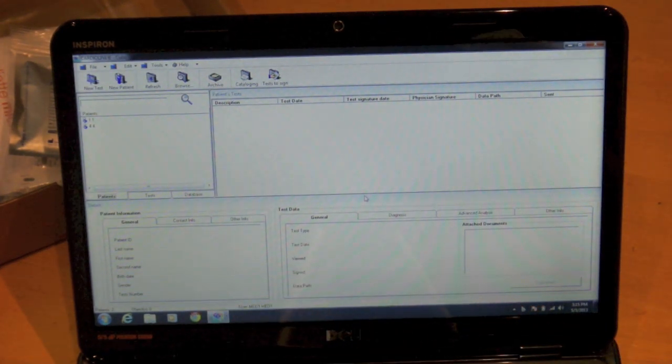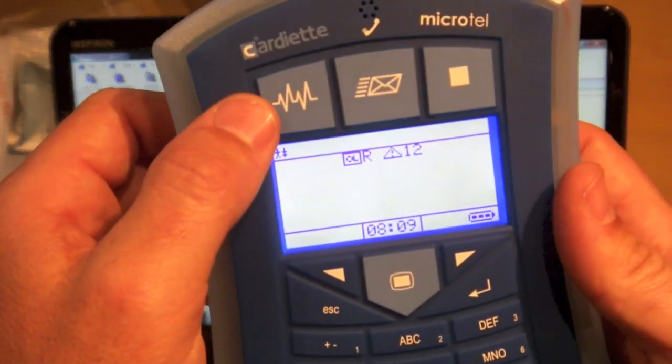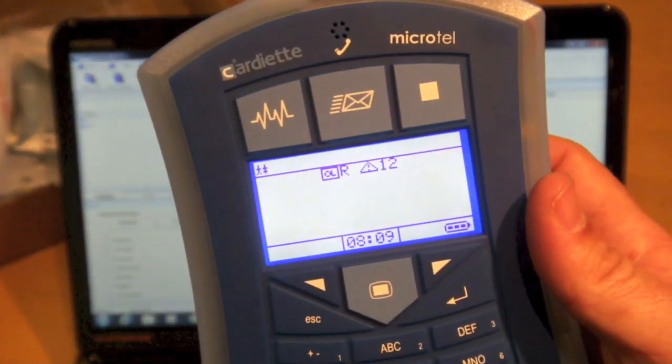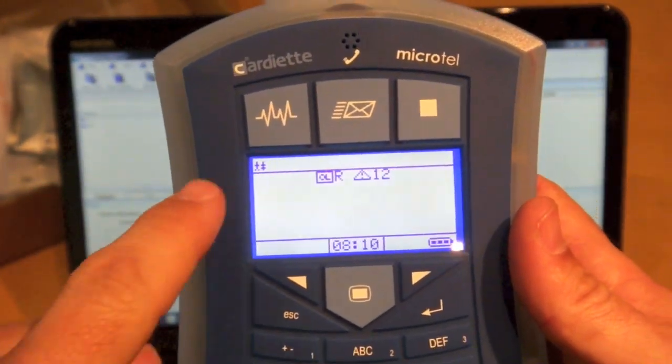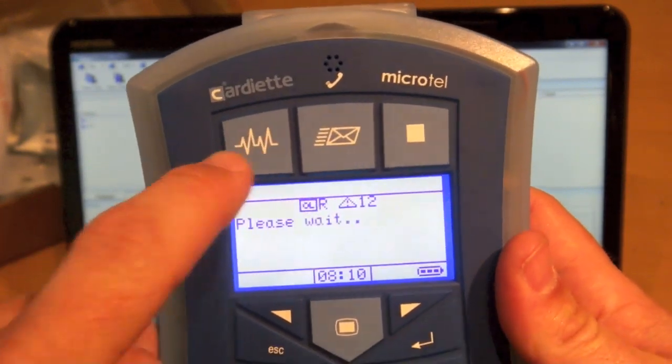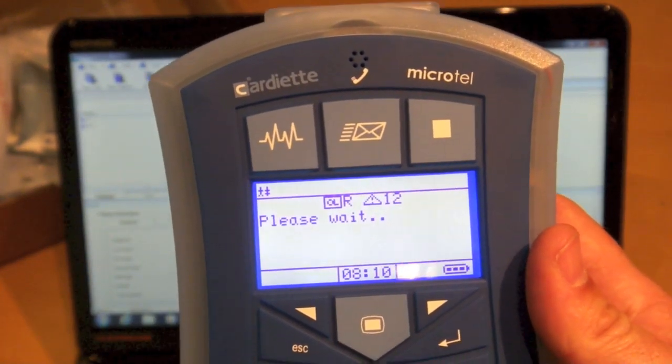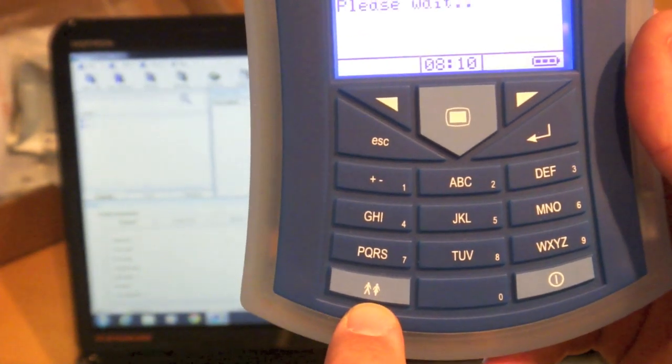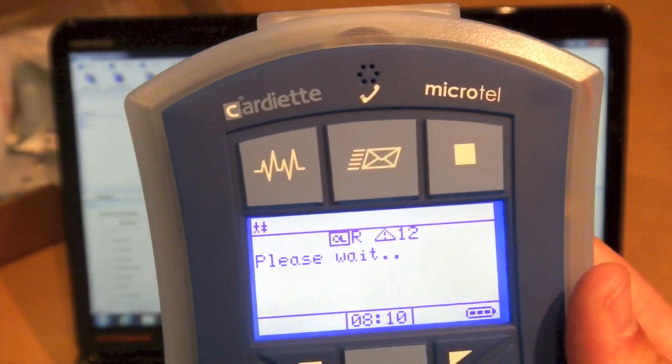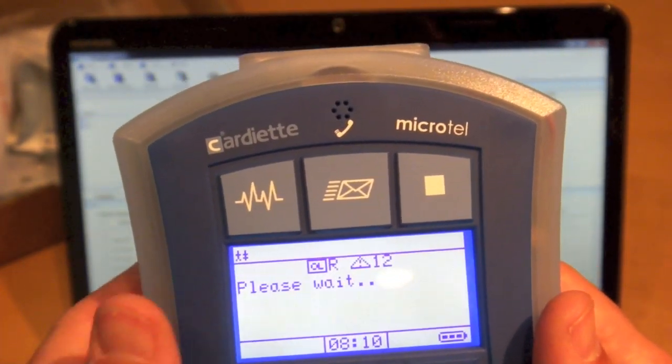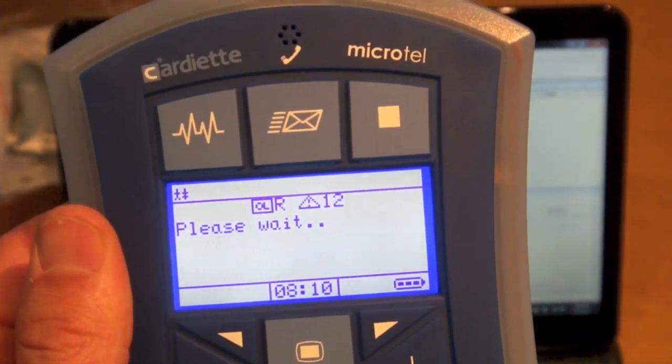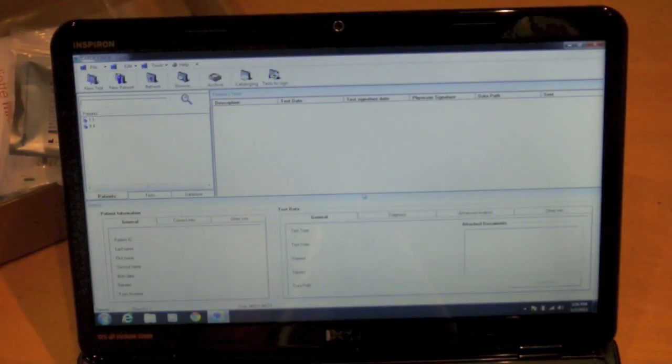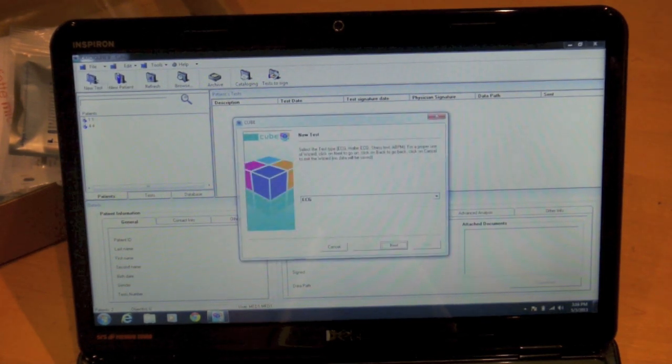I'm going to go ahead and have the device configured for real time PC mode. So I'm going to go ahead and press the test button. You could enter the patient information here but I'm just going to go ahead and send one over right now. It does feature Bluetooth wireless technology. So it's going to give me a please wait until I press here on the computer screen, new test.